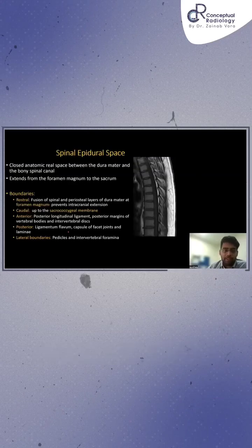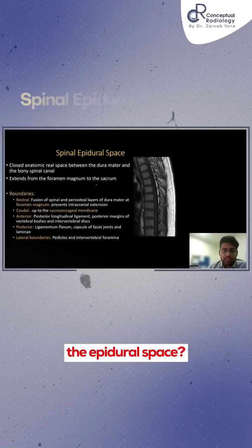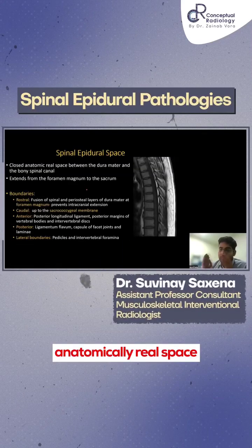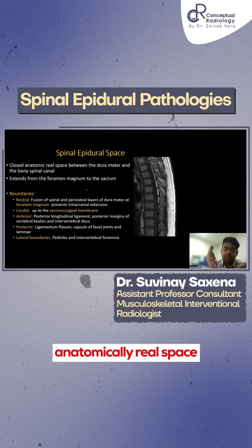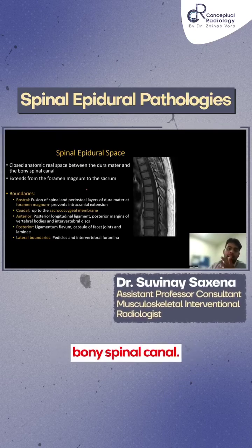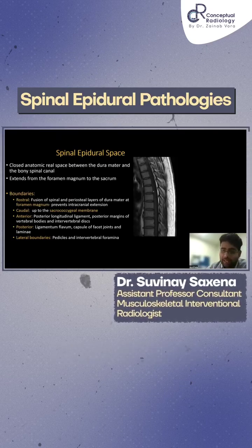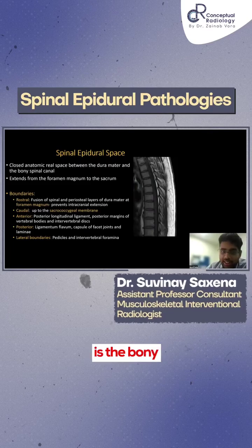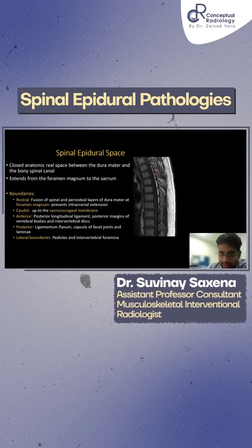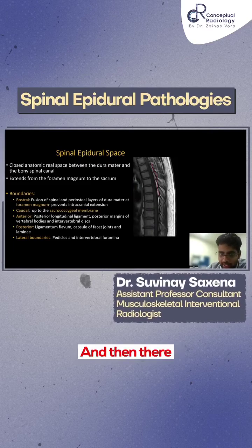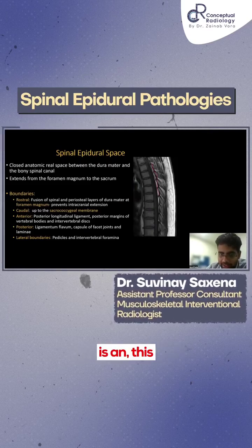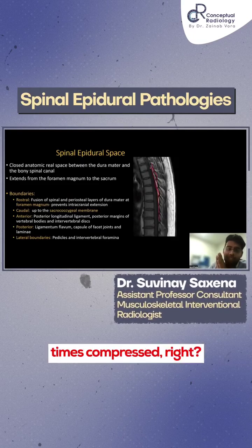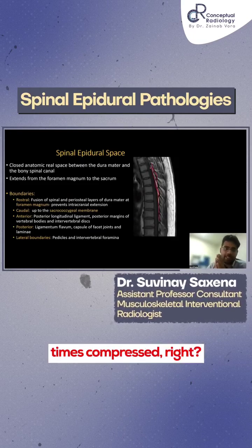So what is spinal epidural pathologies? What is the epidural space? It is an anatomically real space between the dura mater and the bony spinal canal. You can see that this is the bony spinal canal here, and then there is an anatomical space which is most of the times compressed.